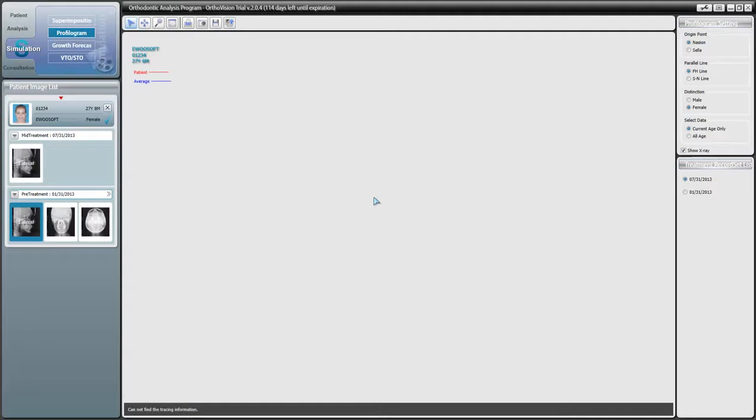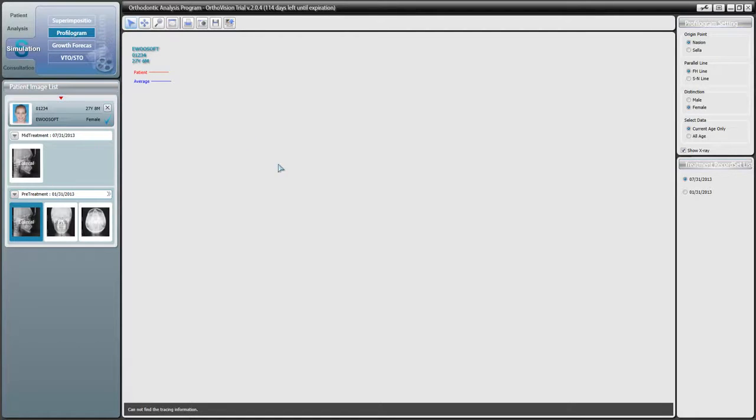Welcome to the Introduction to OrthoVision's Profilogram feature. To get to the screen, make sure you have Simulation and Profilogram selected in the upper left menu.